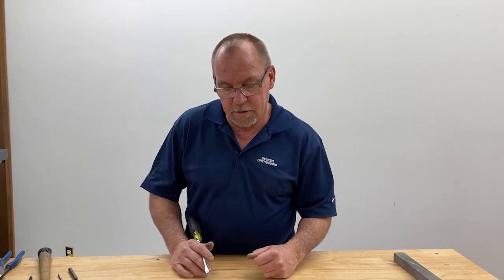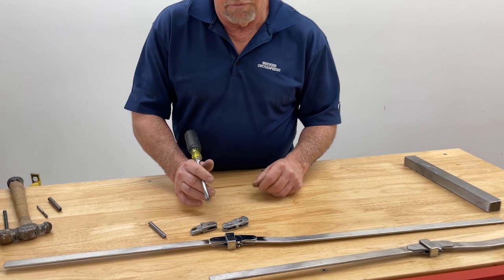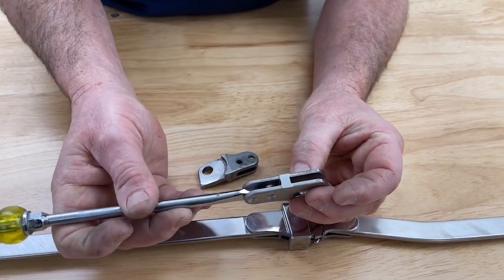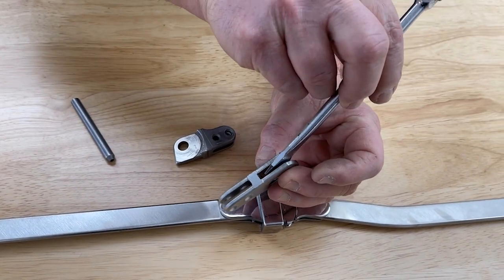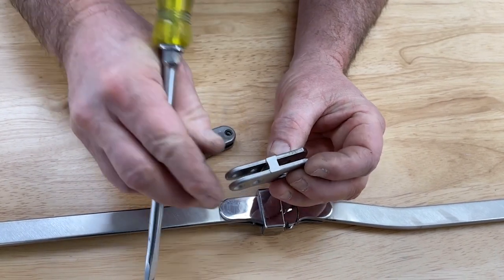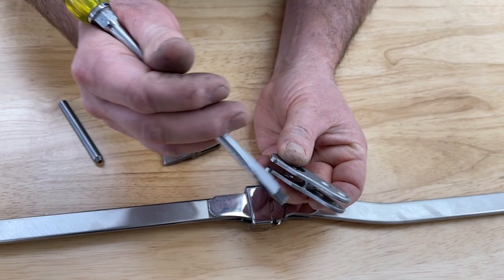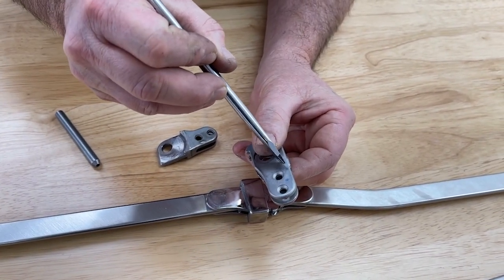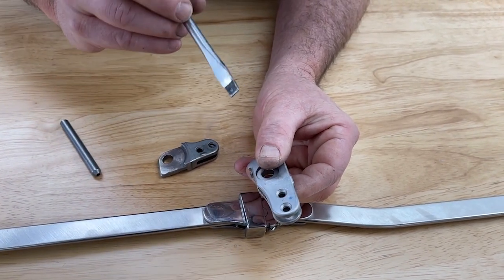I wanted to talk first about the placement on the casting for the ball catch. There's a bar clevis where we rivet the bar in, and there's also the lower joint clevis. The part in between that's putting them together we call the bridge. We don't want to drill through the bridge or install a ball catch through that bridge because it's detrimental to the joint.